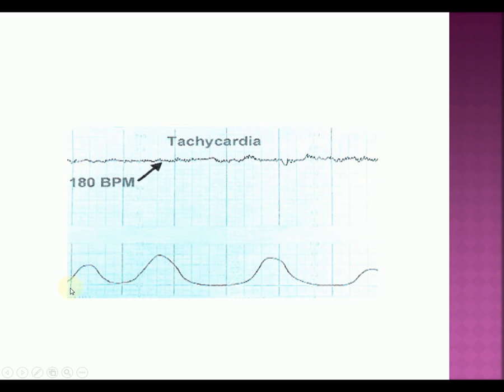When you're actually going to have to read this, you have numbers alongside here that actually tell you whether these are 5 or 10-second ones. So depending on, if this was 40 and this was 20, that would be a 20, plus this was up here at 80 minus 20, which would be 60. 60 plus your 30 is 90, and so forth until you reach that 10-minute window to get your Montevideo units. Basically, if you will just remember that you can only figure Montevideo units with an internal catheter, you will be able to get the question on the test.